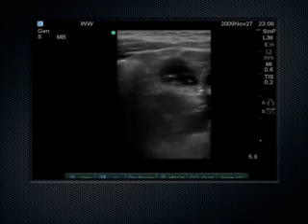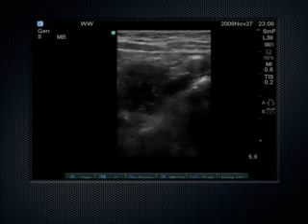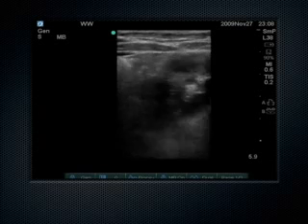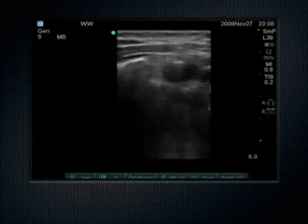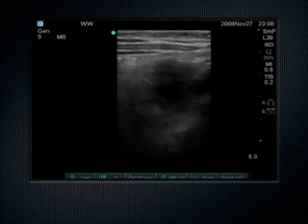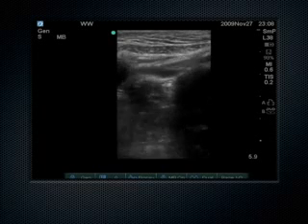Now, if you have appendicitis, all these areas down here in the peritoneal cavity get inflamed, and it's very painful to be compressing these things. This is the peritoneal lining right here. I can see that peritoneal lining very easily on ultrasound. Everything down here is all intestines, and there's psoas muscle coming all the way up and coming in contact with abdominal wall musculature.